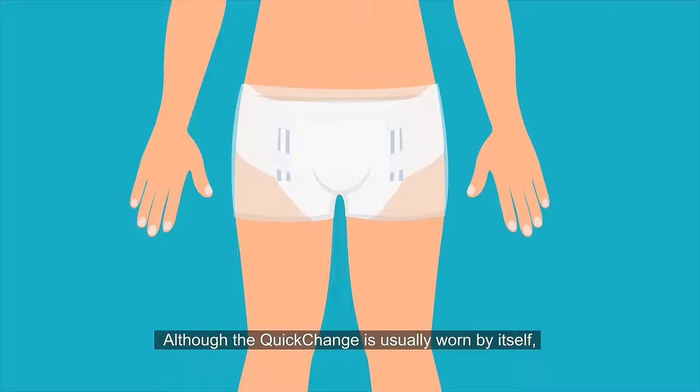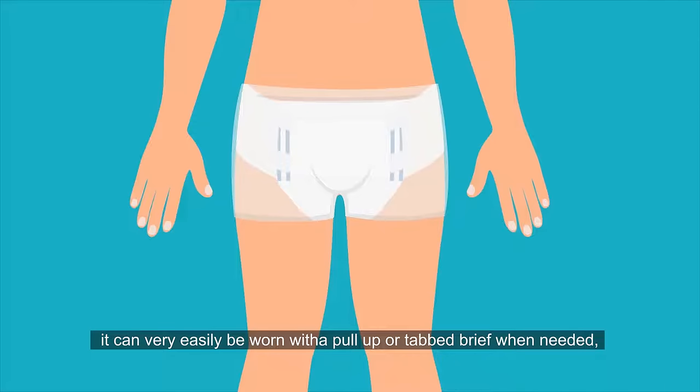Although the Quick Change is usually worn by itself, it can very easily be worn with a pull-up or tabbed brief when needed.